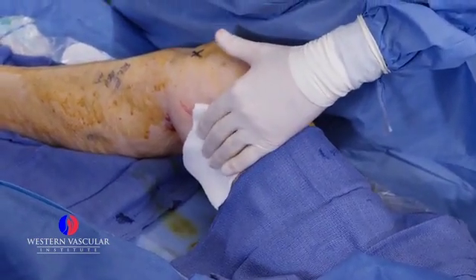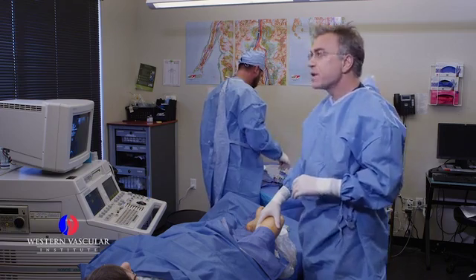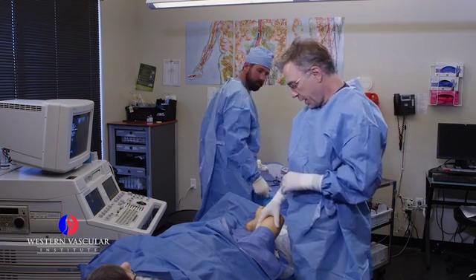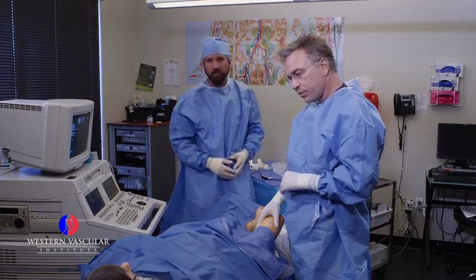Right now we're going to put a compression dressing on the patient. She'll have some postoperative instructions. We'll do a follow-up ultrasound to make sure the vein is closed and evaluate the patient in about three days.